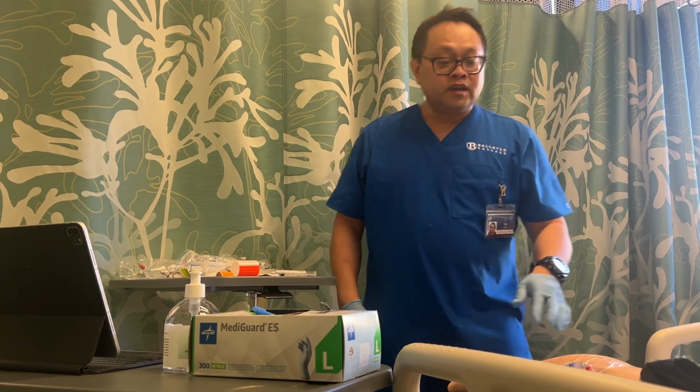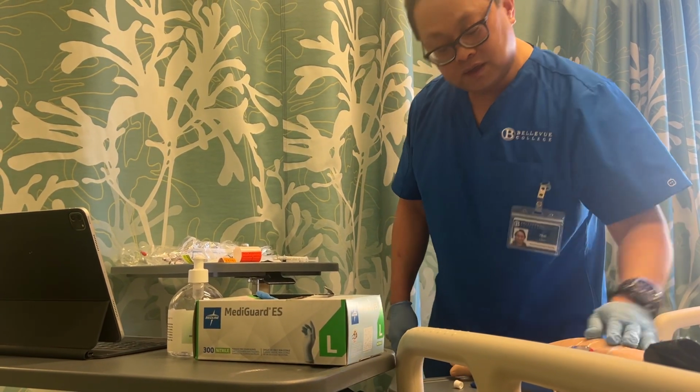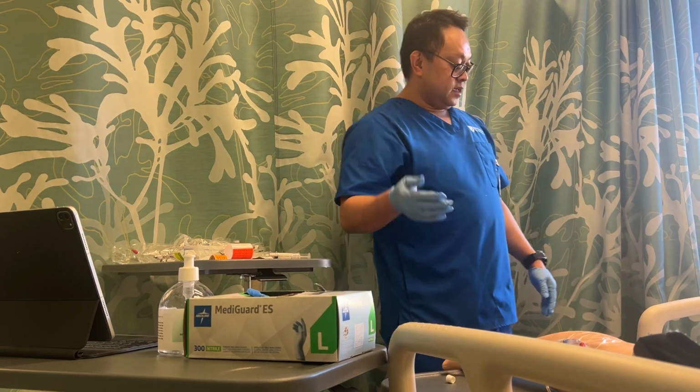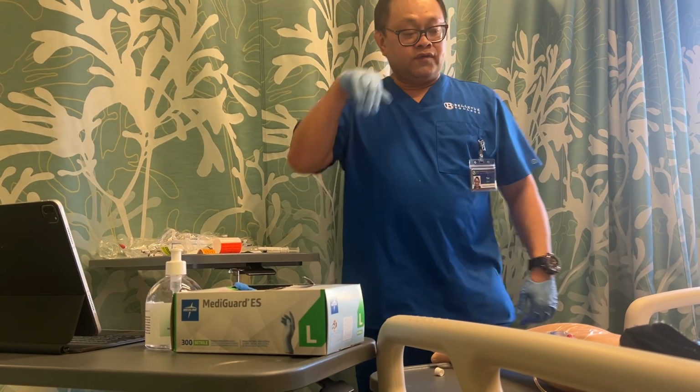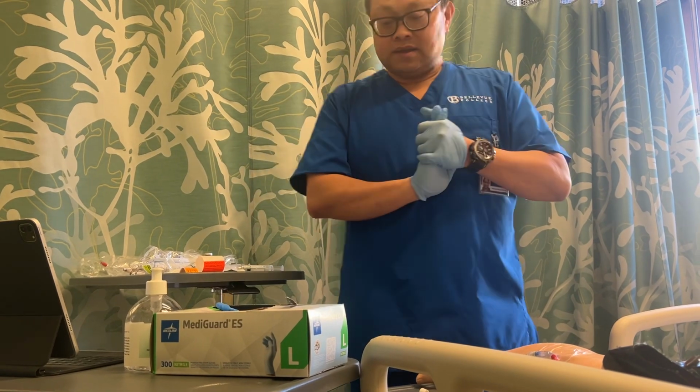Okay, are you feeling any pain? No, I feel okay. Okay, so we're checking again for leakage, for phlebitis, and anything else. And depending on your facility, I would change gloves again, sanitize.